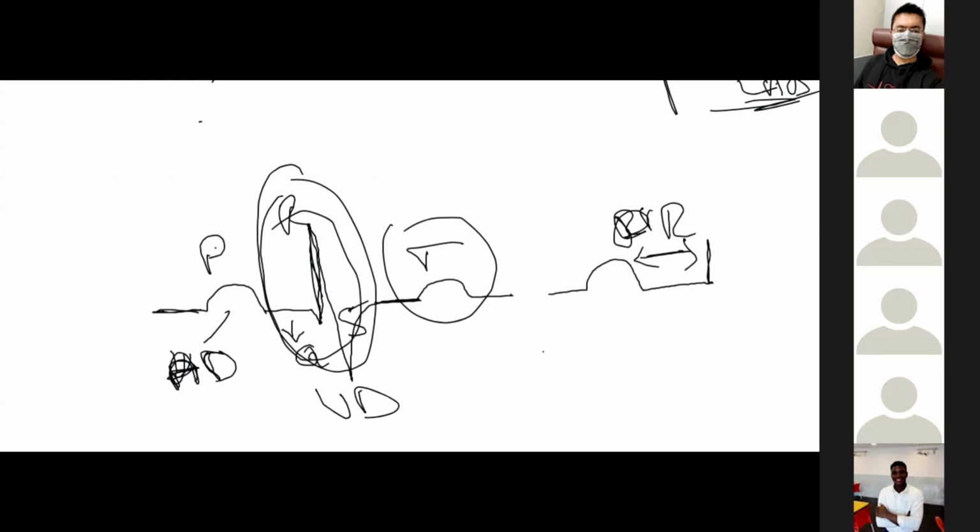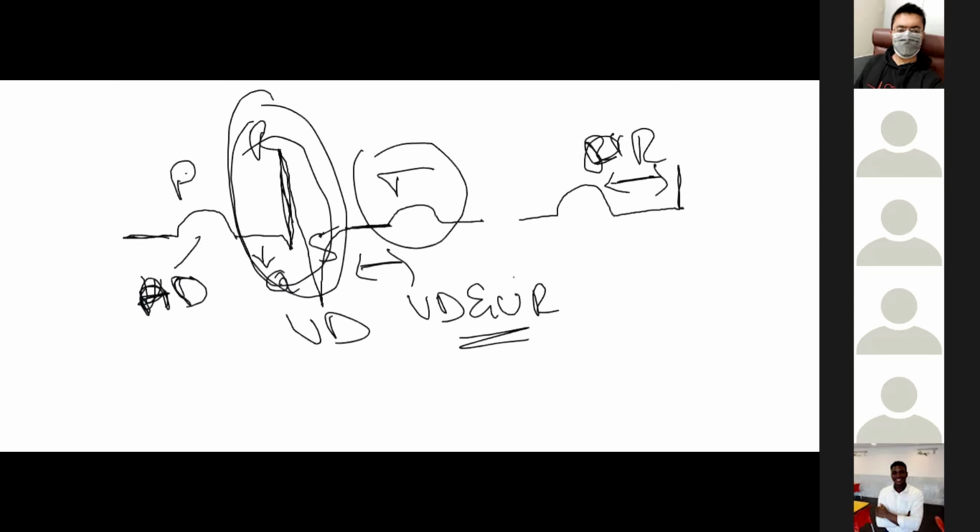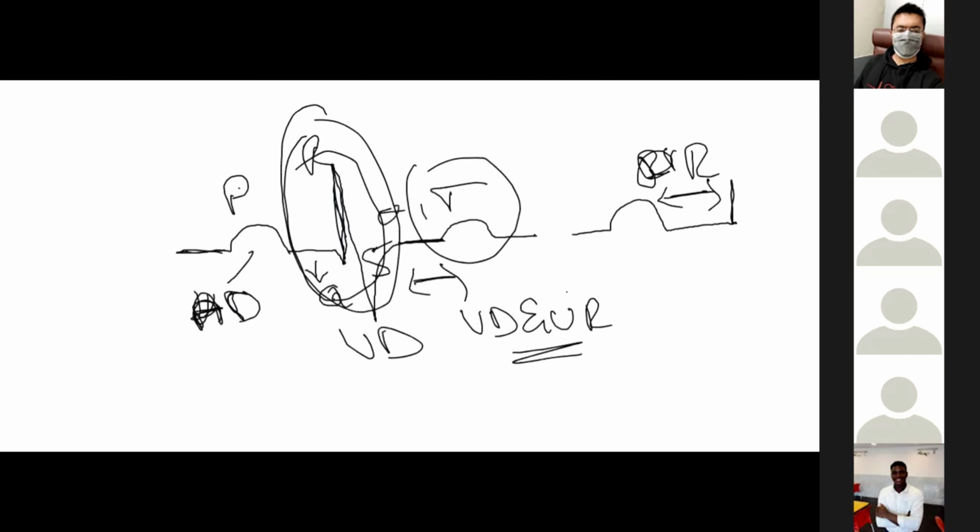The ST segment is an isoelectric line, and it basically shows the period between ventricular depolarization and ventricular repolarization, right? And there's a QT interval between this. T wave is ventricular repolarization basically.